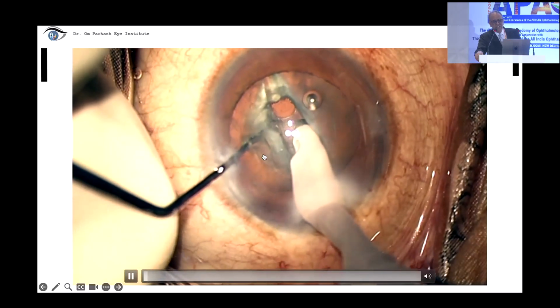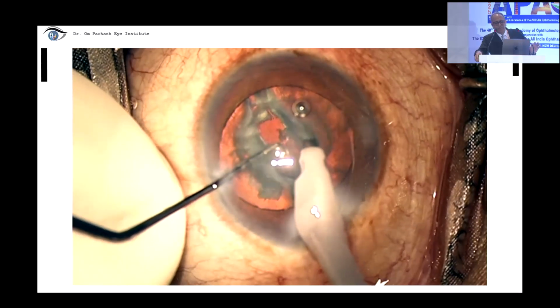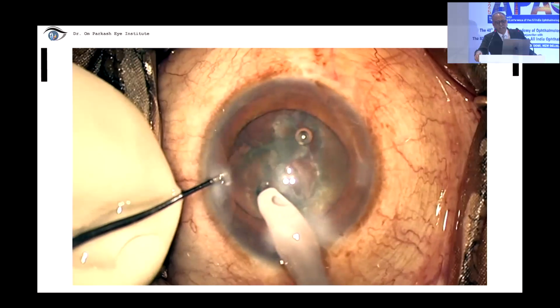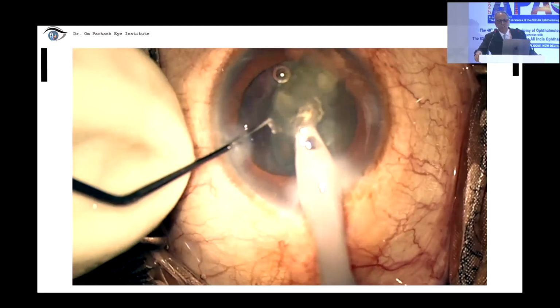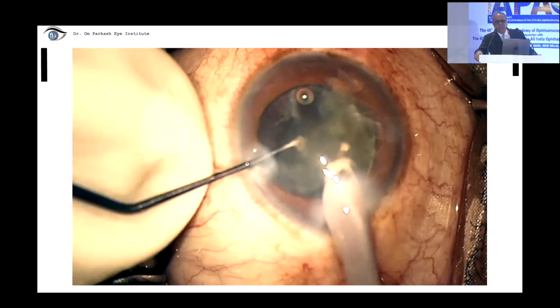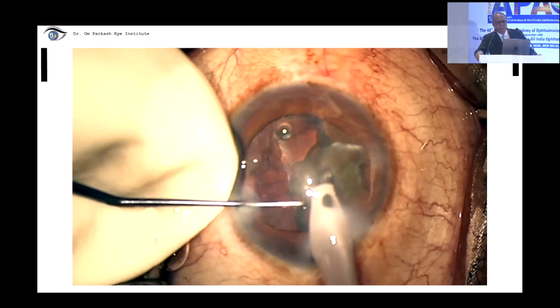So the patient was shifted. I did separation, not extensive separation, since hydrodissection had been done and it had been separated. I did exactly what David said, tried to pull it out, which I was able to because the adhesions in this grade 2 cataract were not that profound. I did supracapsular emulsification in this soft cataract.